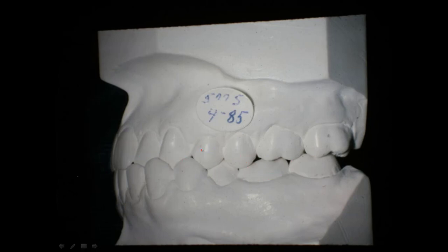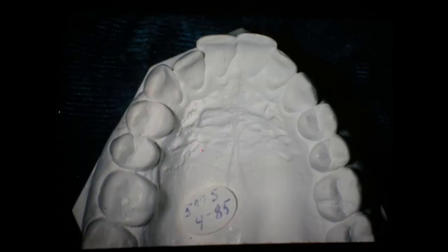All right, we'll go through this. There's 2 or 3 other little things in it that we'll do too. Rarely do you get a case that just has one problem. So anyway, this is the model, and that's kind of what we're going to do to correct the Class 3. And when you look at it from up above, it's no big problem that I see here. This will come out, and that crossbite will just bring that out over here, just expand it some, and come in over on the other side.